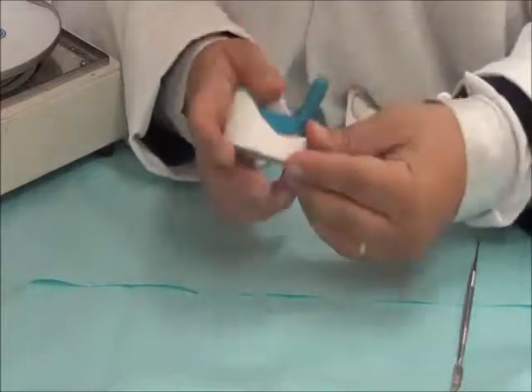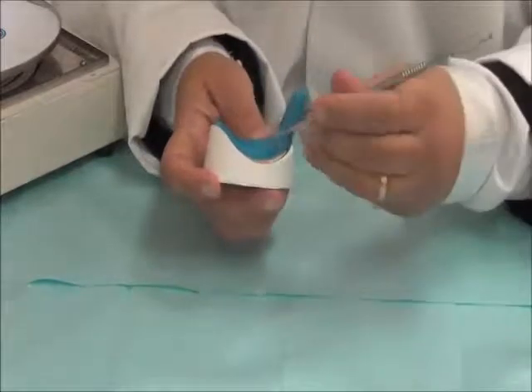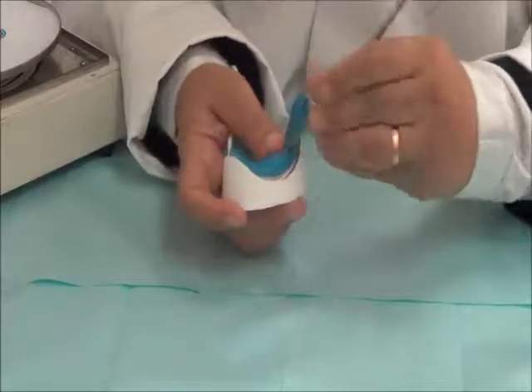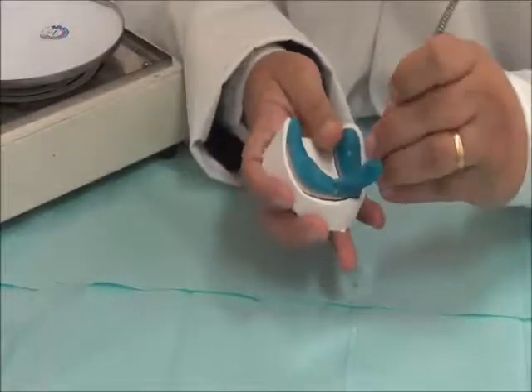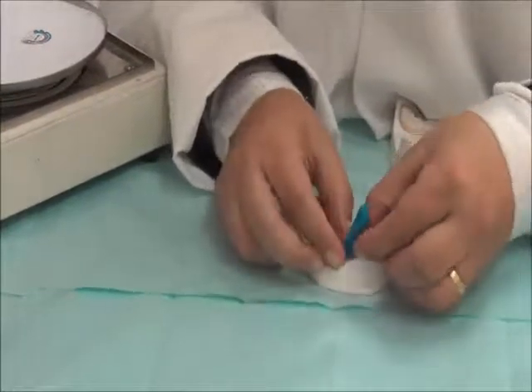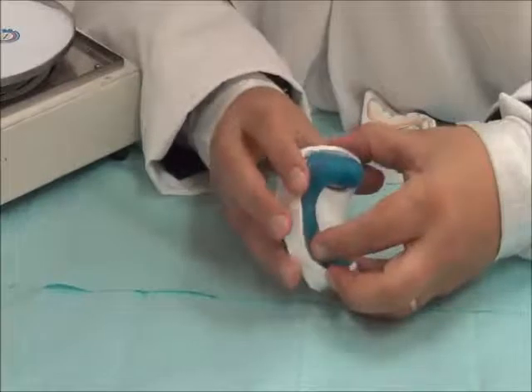And to make sure that it's adapted well, when we have done the first layer, we don't place Vaseline in this area to make sure that the handle adapts to it. And wherever a hole is covered, we re-expose it to make sure it's still present in the handle as well. So the handle is in. We thinned it. We have removed the bulk from here. We have removed the bulk from here.